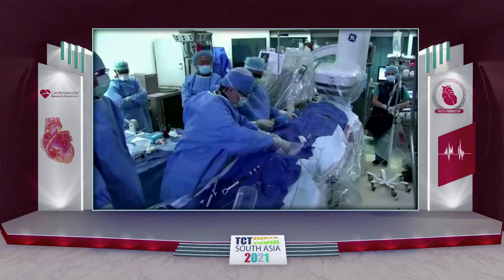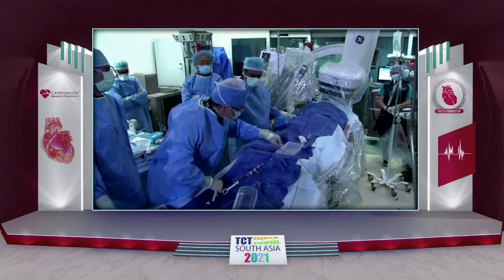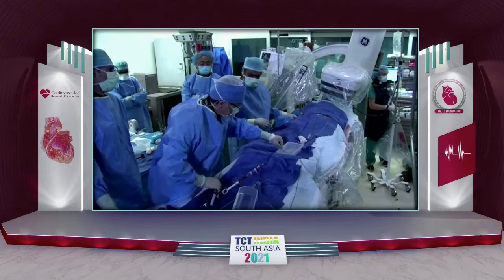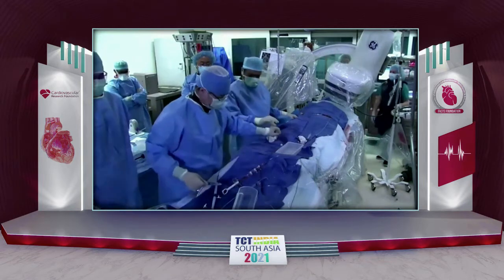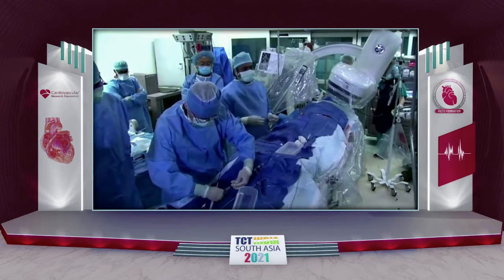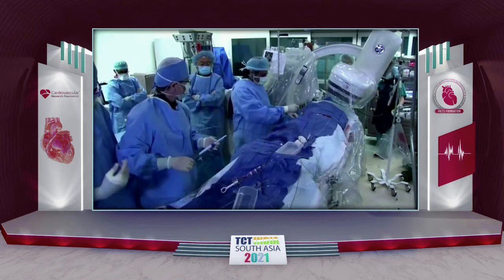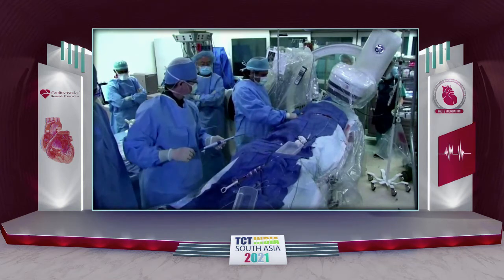Hey, Raj. Good morning. It's Saurabh from Portland, Oregon. Good morning, Saurabh. Talk to us a little bit about your strategy around where you might use TEE up front rather than just, for example, by happenstance, as in this case.